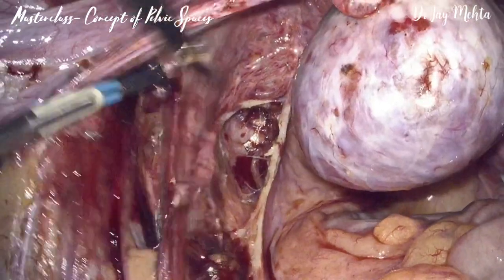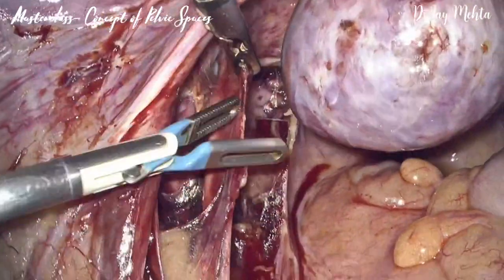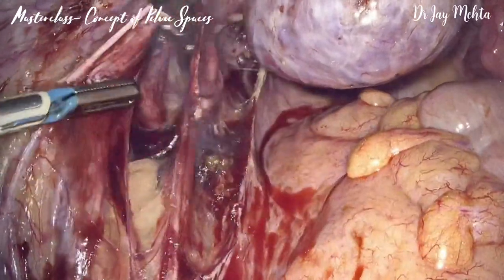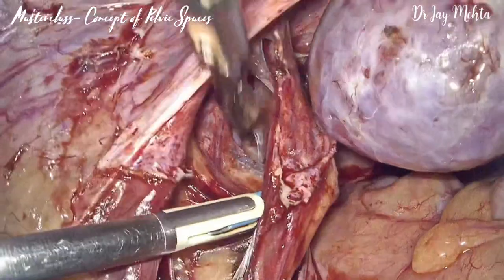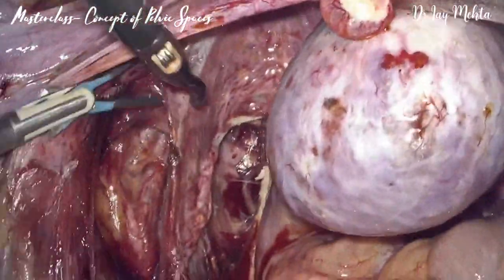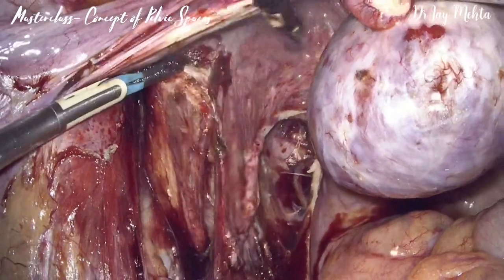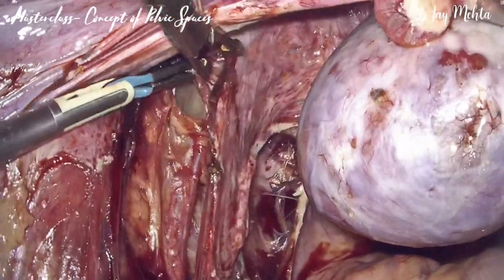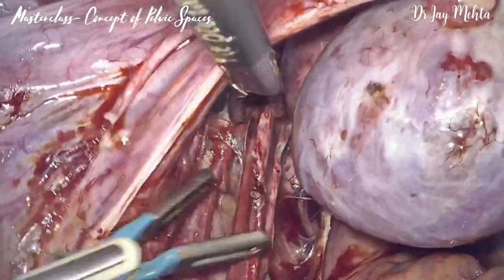If we keep dissecting into the lateral pararectal space — that is, the space lateral to the ureter — you will begin to identify the internal iliac artery, the anterior division of the internal iliac artery, and that is the first structure you are going to identify there. This is practically the importance of this space. This is an absolutely avascular space — we are not using any form of energy source to open it up. It is just traction, counter-traction, and gentle dissection. This dissection is being performed live and is not a very time-consuming dissection. We have now gone ahead of the uterine artery and the space which has opened up there is the paravesical space.